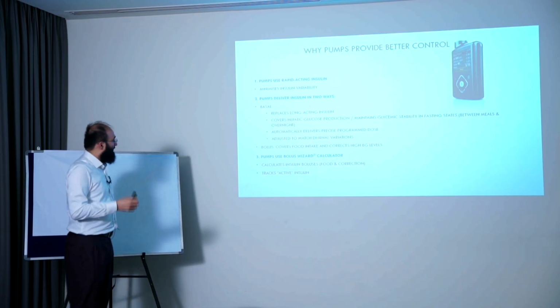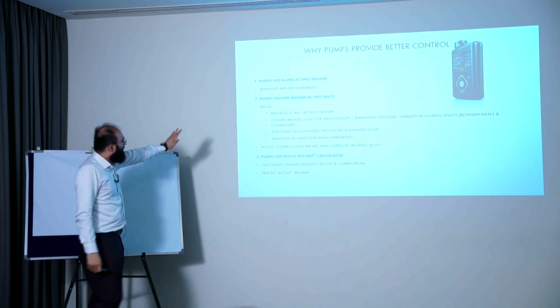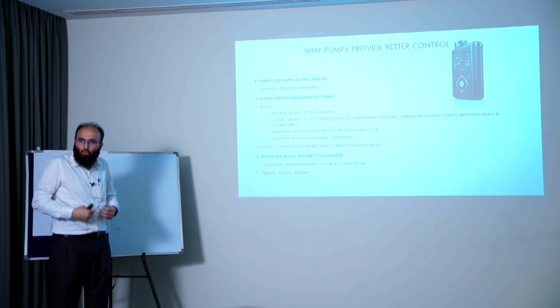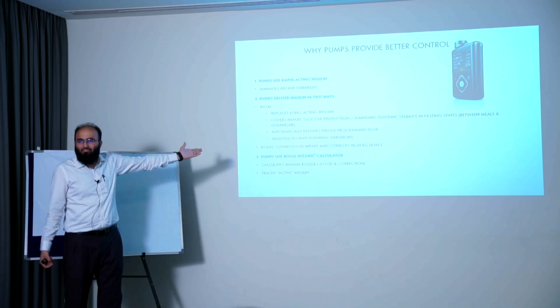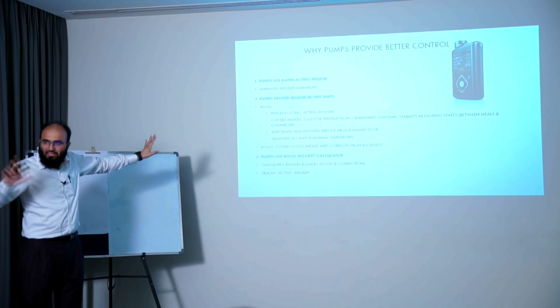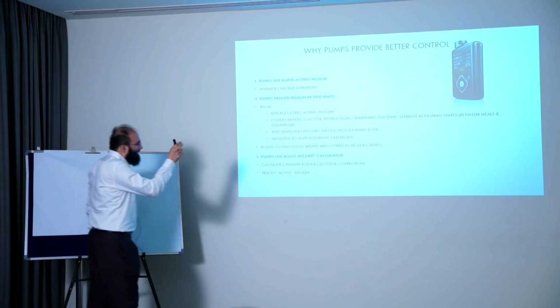And the pump delivers insulin in two ways. It can be a basal or a bolus. The same insulin, it is delivering in two ways, the way the patient wants it. So basal replaces long-acting insulin. It covers the hepatic glucose output. Whatever glucose is being poured by the liver into the blood, this insulin takes care of. Which oral antidiabetic drug takes care of this? Metformin. It maintains glycemic stability in fasting states. So in between the meals and at fasting, this is what it is taking care of. It is like any basal insulin, and it automatically delivers precise programmed dosages. It adjusts to match diurnal variations.